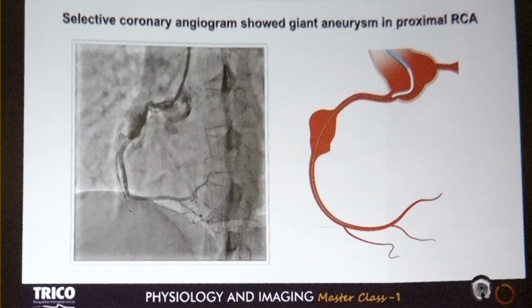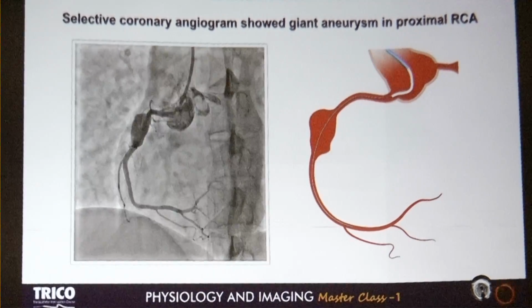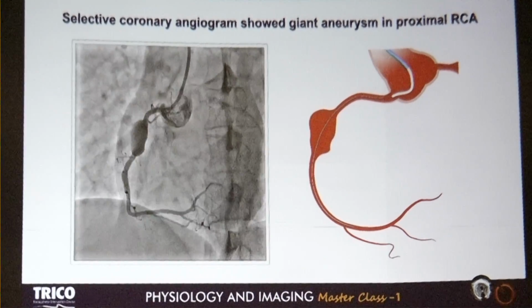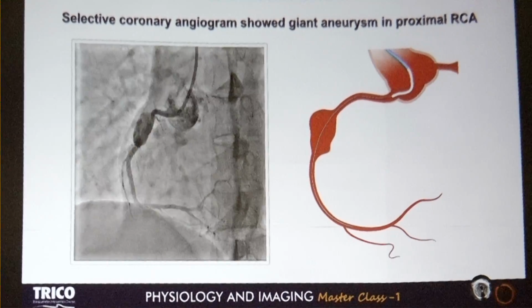Unfortunately, we thought that a 26 millimeter Papyrus should be fine in this case to fix it. But when we measured the length by putting the wire, the length was coming at nearly 30 millimeter. So what to do?